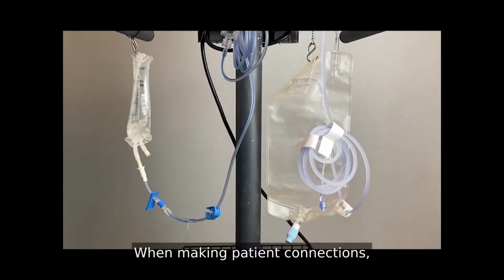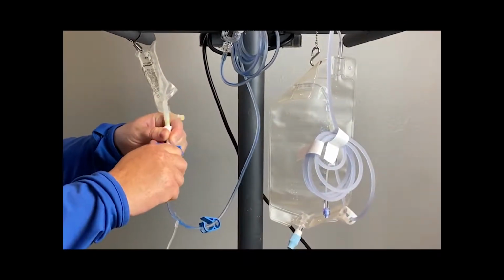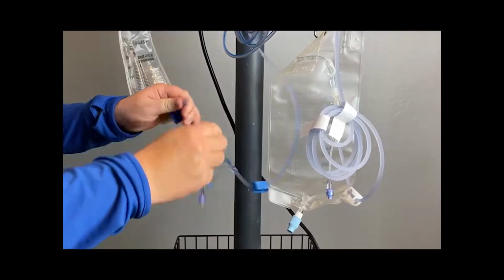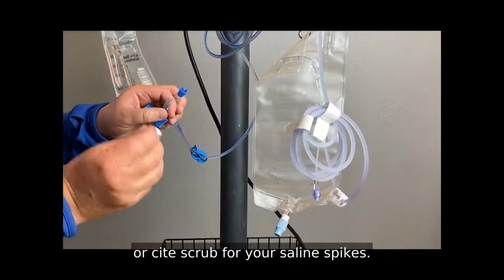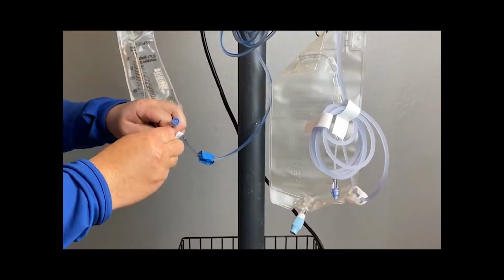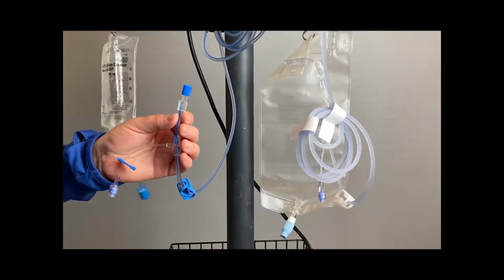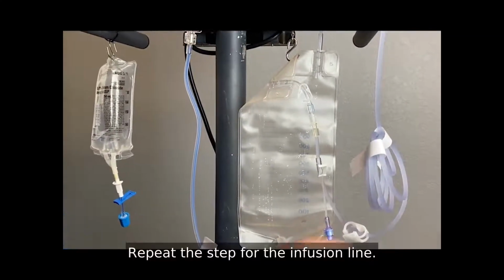When making patient connections, clamp saline line circuit, clamp circuit line, disconnect, use a dead end cap or site scrub for your saline spike. Leave to hang. Connect to patient. Repeat the step for the infusion line.